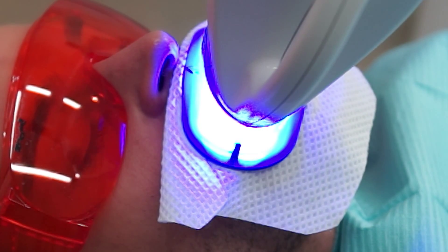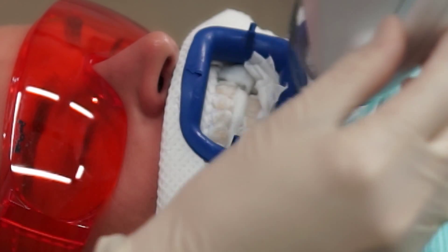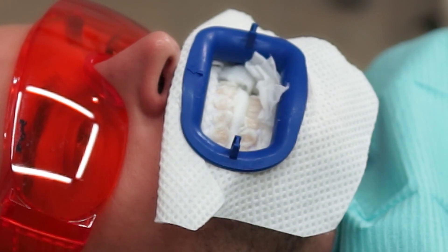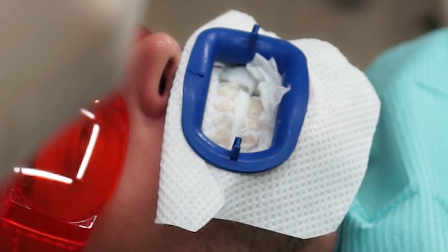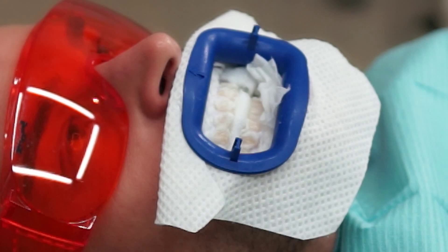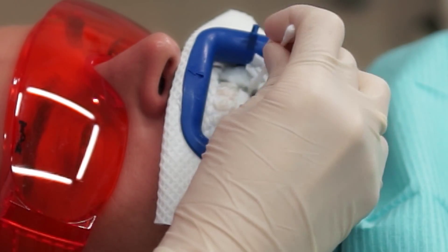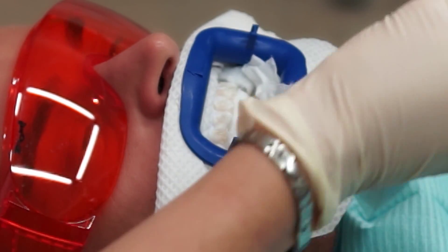Zoom whitening is one of the most advanced systems available in the market today. It does have some competitive companies, but it's an excellent American product that helps change the shade of the teeth between three to eight shades on a scale. In between the 15-minute cycles, the gel is first removed and a new application is made on the outside of the teeth surfaces.